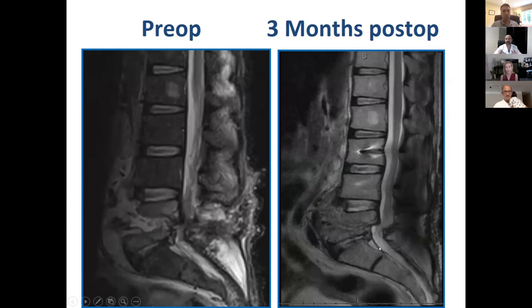Now, is this guy going to fuse? Is he going to fail here above? I don't know. But I'm happy with this result at 3 months. Of course, the guy was lost to follow-up. This was done many years ago. But it's okay to put different hats on and use different skill sets. So this was a completely MIS case, if you will, that I think has an acceptable result for what could have been the alternative.